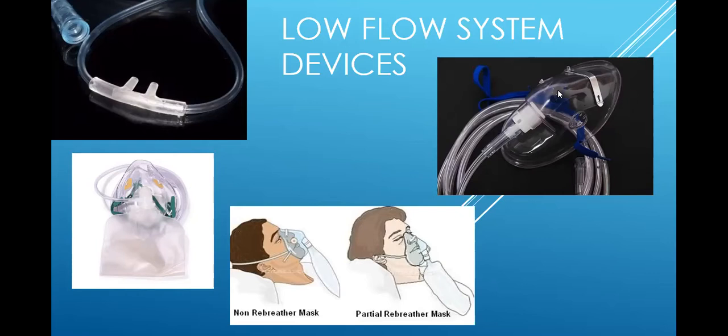Then if that's not enough, we can go up to a non-rebreather or partial rebreather mask, okay? So this one right here is a non-rebreather mask, and the partial rebreather mask looks just like it, but you're going to find there's just a couple of things that are different, all right? All right, so let's look at them.